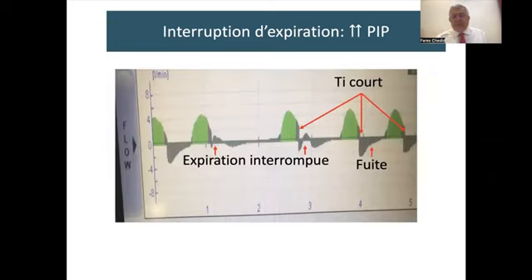Again, here is a patient of mine. That picture is quite complex because many things have happened, but amongst them there is one interrupted expiration. You see, the patient started expiring, then he inspired, and then he expired. That amount of expired volume will be taken as the total expired volume, and the next breath will shoot up its PIP.